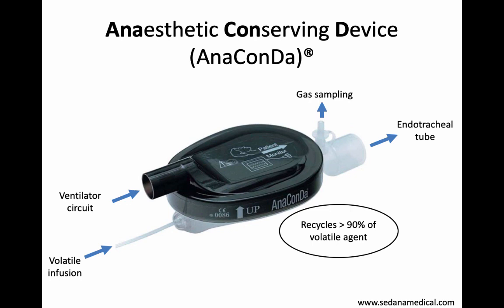In addition, the Anaconda is also a conserving device. It actually recycles more than 90% of volatile agent that the patient breathes out. So whatever volatile agent the patient actually expires is usually reflected back to the patient, and less than 10% goes back to the ventilator exhaust.